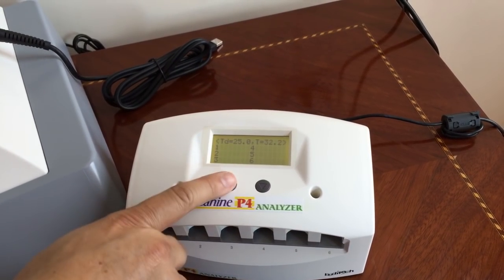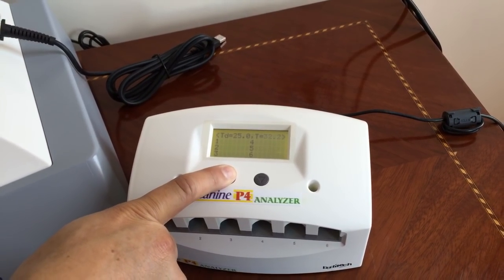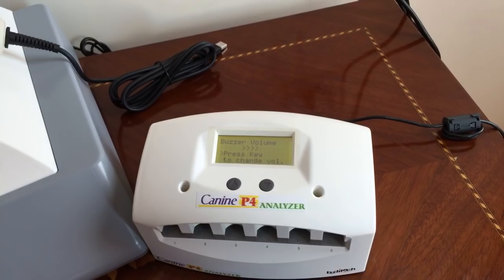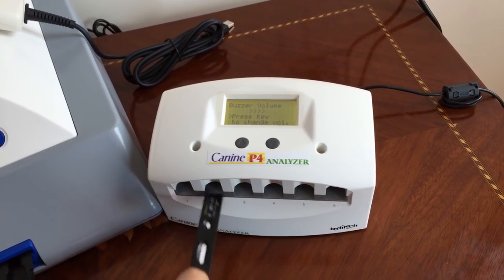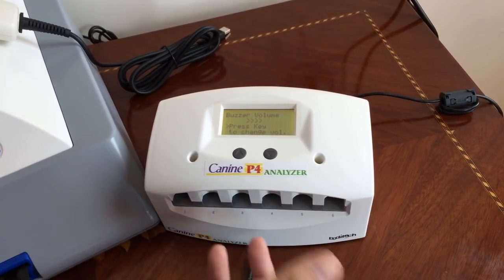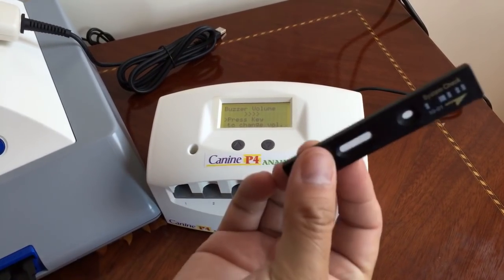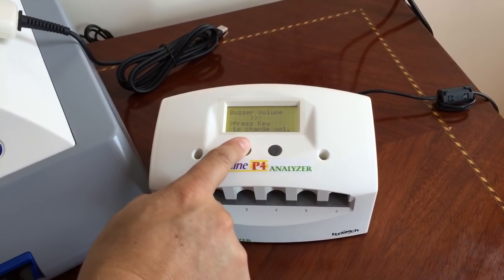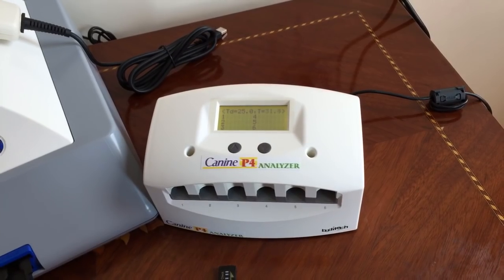If you press this button right here, it takes you to the volume settings. This has an alarm, so when the timer reaches 15 minutes the alarm sounds off. Each one has a different timer, so you can put up to six different tests at six different times and it will still trigger the alarm for each strip. Press both buttons to go back to the main menu.